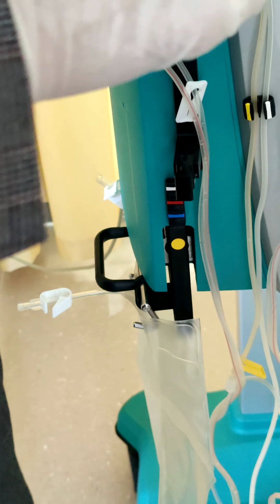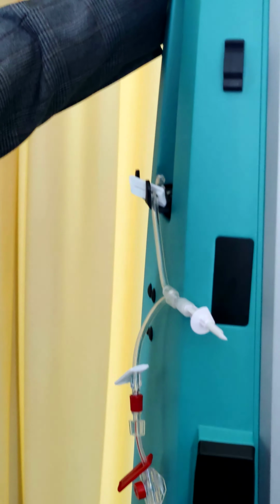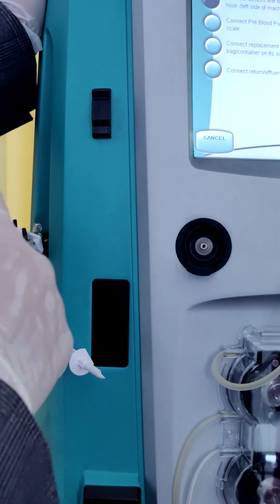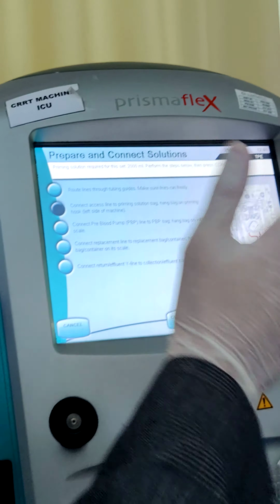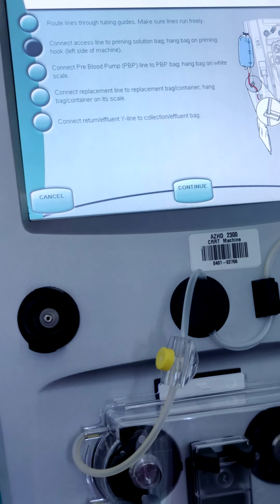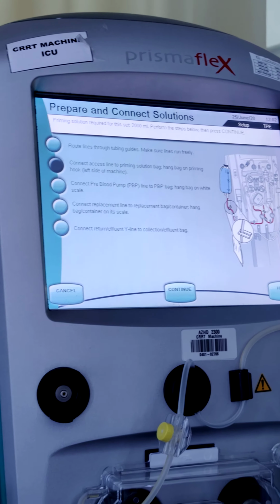Connect the access line to the priming solution bag. Hang the bag on the priming hook, left side. Okay, what we will do now, we'll connect the red one with the saline bag. Here in this small TPE 1000, only 2,000 ml priming volume is needed. For our adult, it will be 3,000. This will not be calculated as patient balance, it will be only in the tube. This is for priming.